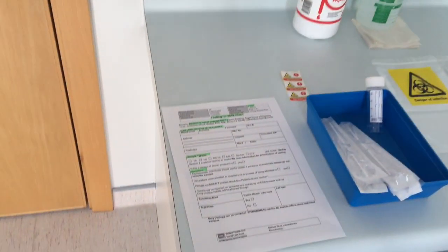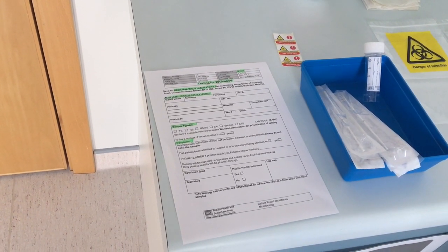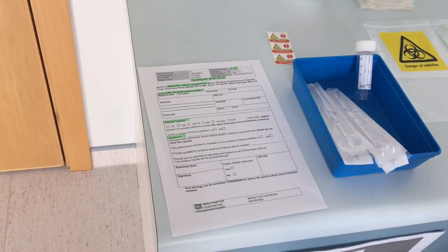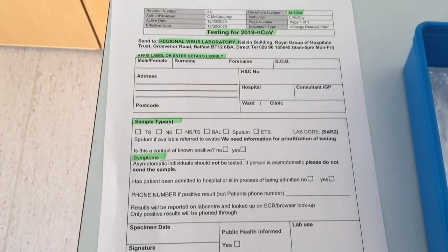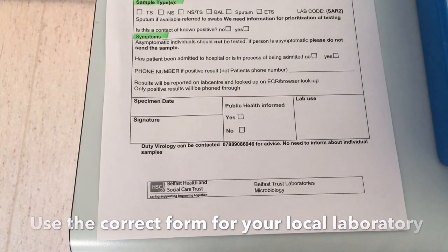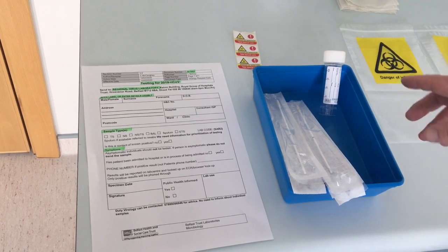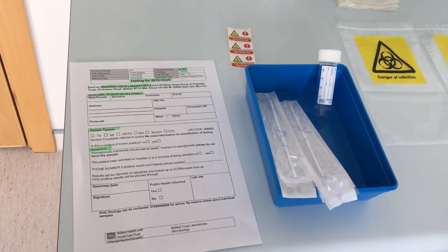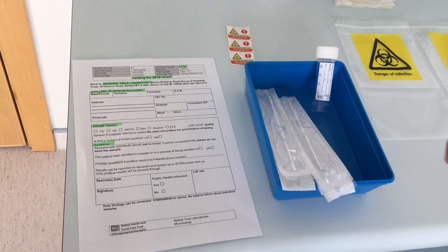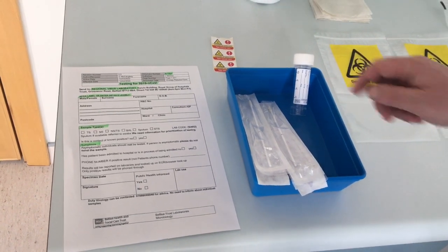First, I'm going to show all the different things we need in order to take our sample. Most of these things we will have outside the patient's room and we will do all our preparation outside the patient's room. We need a request form — this is from the regional virus laboratory in Belfast — and you need to fill that out completely. We use two dry swabs, one for the nose and one for the throat, and then we have a white top universal container that these swabs are going to be broken into. Please remember, before you go into the patient's room, to fill out all the details on the request form and on the universal container.